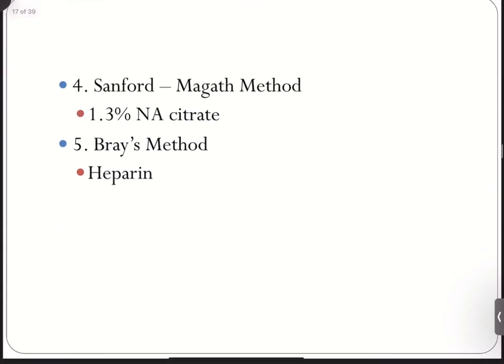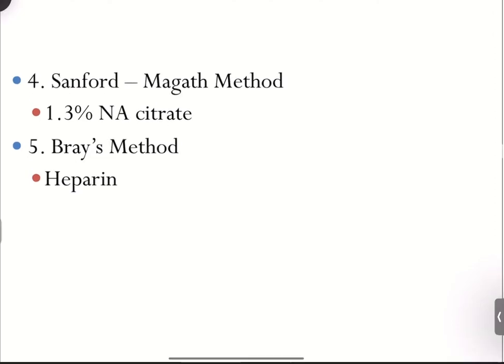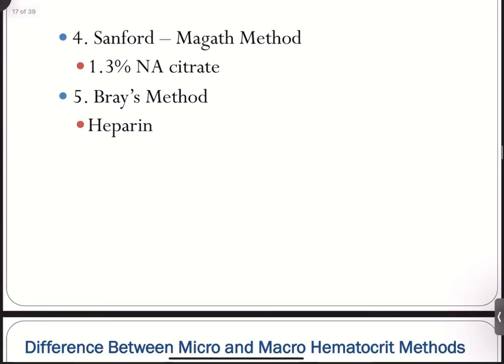Okay? Then you do have Sanford's method, 1.3% sodium citrate, and Bray's method using heparin as anticoagulant.